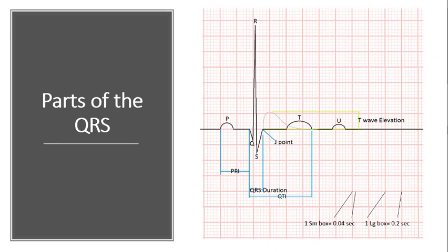And then in this video, I'm also going to be covering the QT interval. This is going to be new. It's not going to be something that typically nursing 212 students or 214 students learn about, but I think it's pretty important because there's some medications and some considerations that we need to take into account when we're looking at the QT.